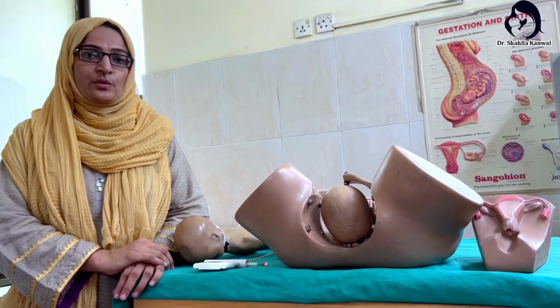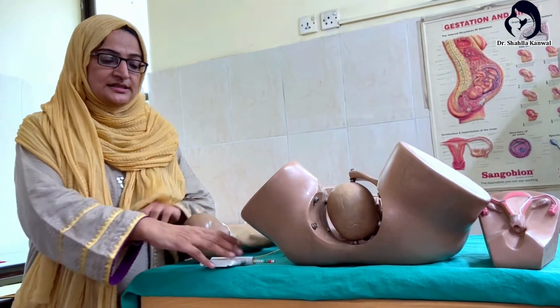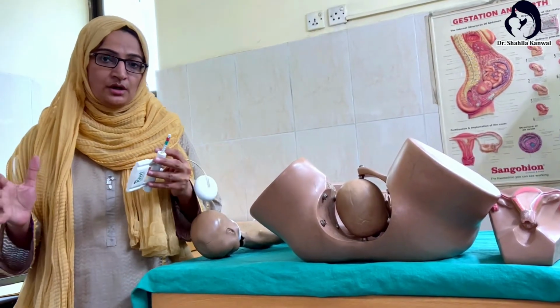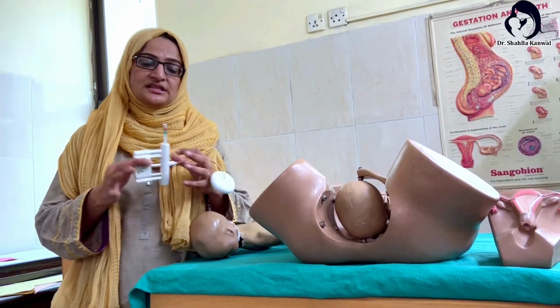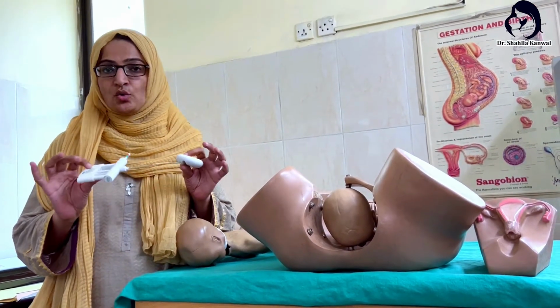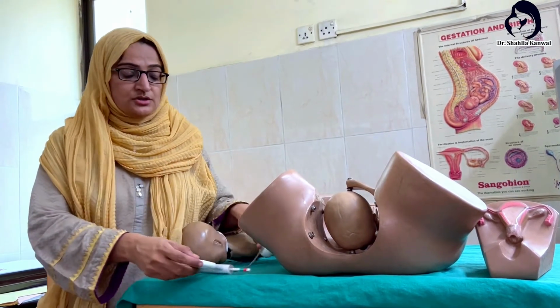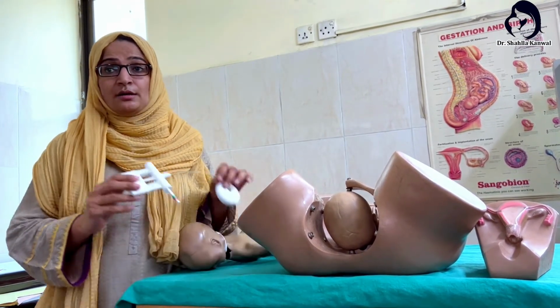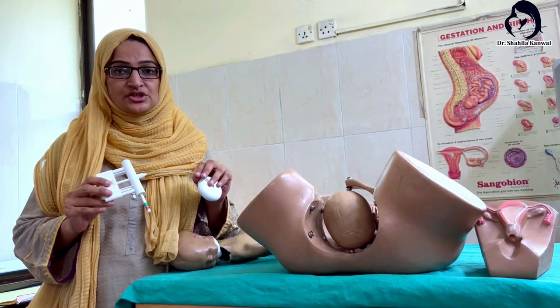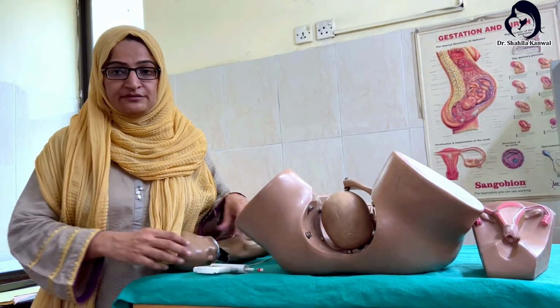The difference between ventouse and Omni cup delivery is this is an Omni cup, but the ventouse has a large machine of the suction. So this avoids that large or big machine of the suction, and it has its own suction apparatus. So this is more like an easy procedure than the ventouse delivery.